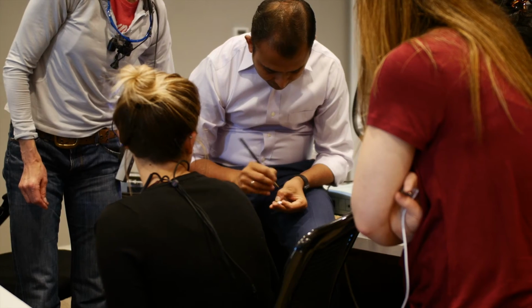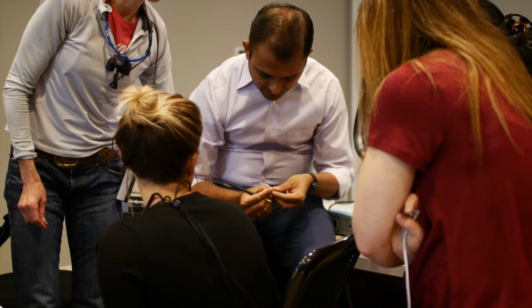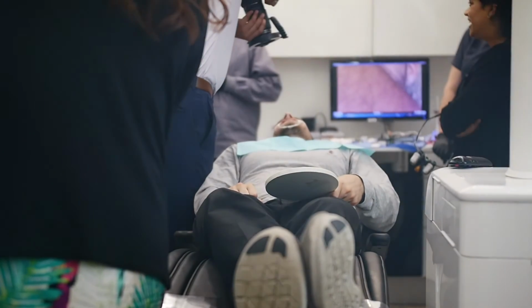It was great to have as much one-on-one as we did have in this course. So I would recommend it for anyone who is either new to CEREC or new to anterior CEREC, or wants a tune-up for any kind of anterior CEREC work.